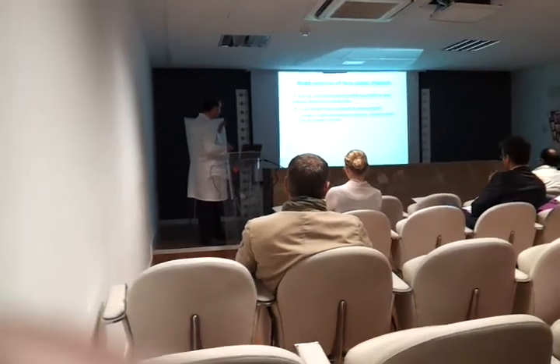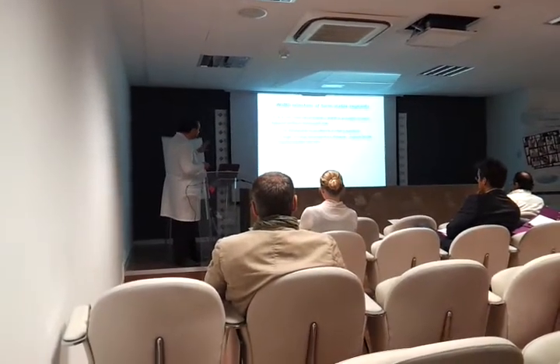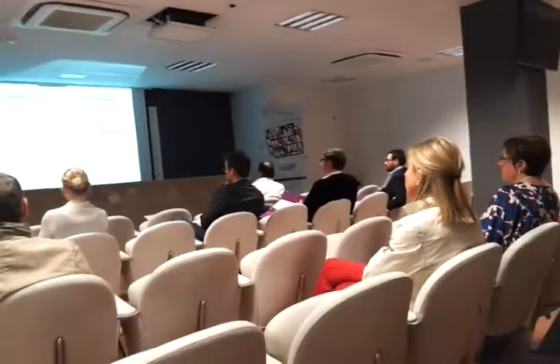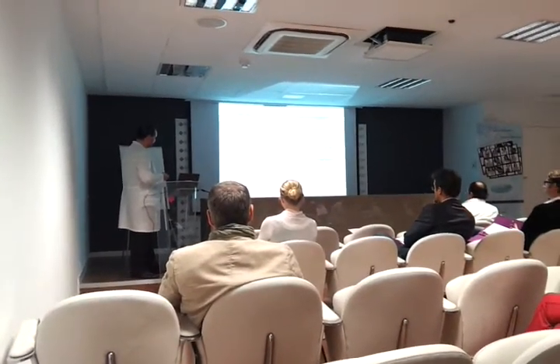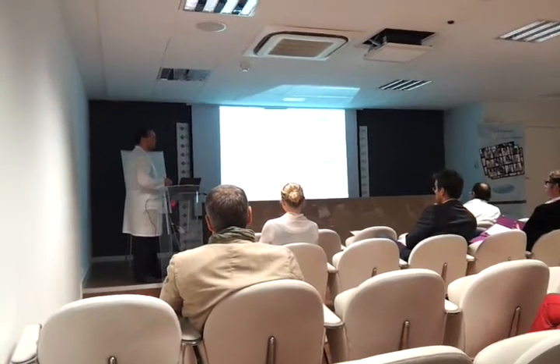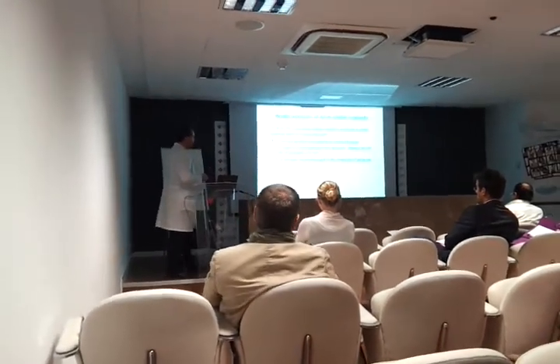But if we select a lateral smart intermammary distance, the implant border may be palpated and seen. So the limit is 1 centimeter from what we decide in the office. Because if we select more than 1 centimeter, it's not recommendable, because in the majority of patients we will have problems: palpability of the implant, symmastia, and bad results.